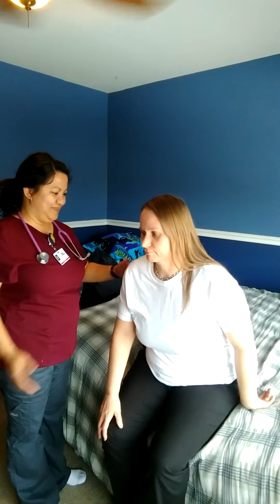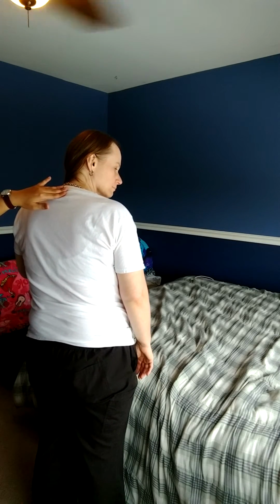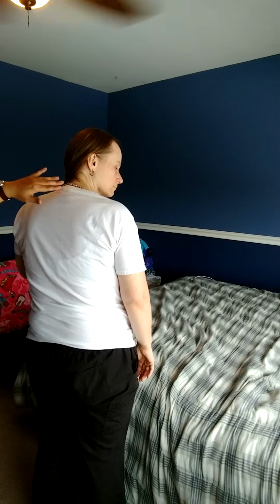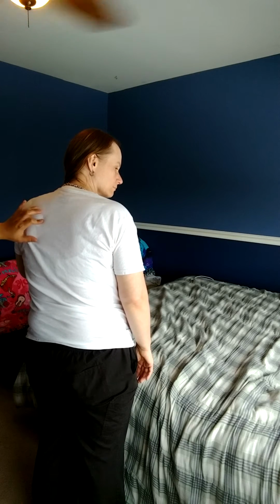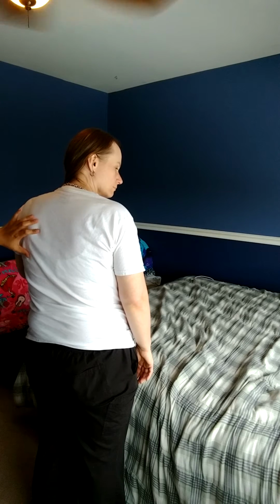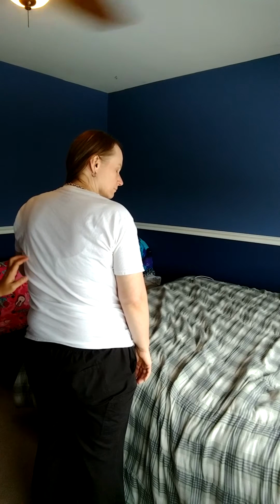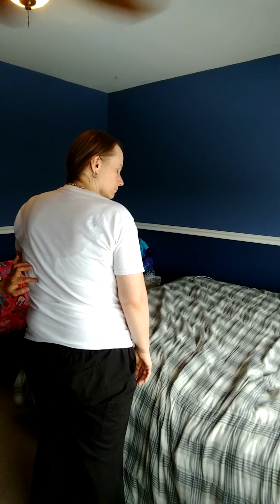I will start on the back side. Okay, for the posterior side, the landmarks to listen for the lung fields are C7 and T1, and then you palpate the scapula, where the bottom of the scapula is at T7, and then go down to T8, T9, and T10.